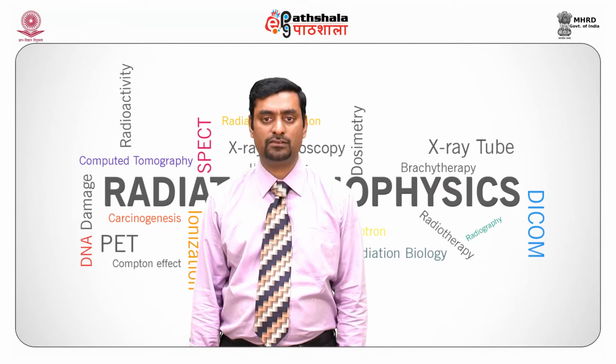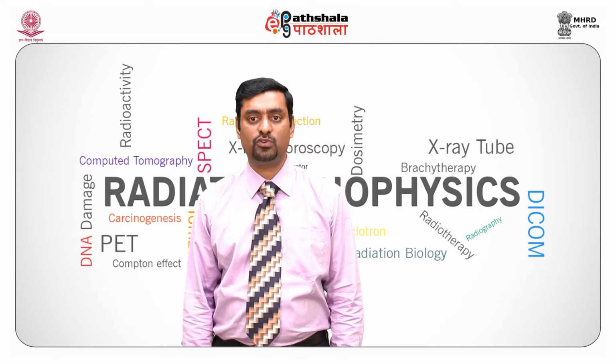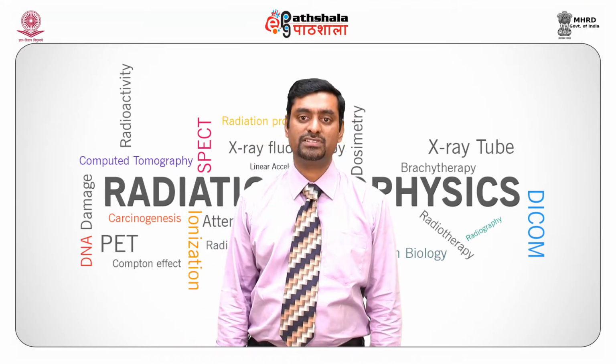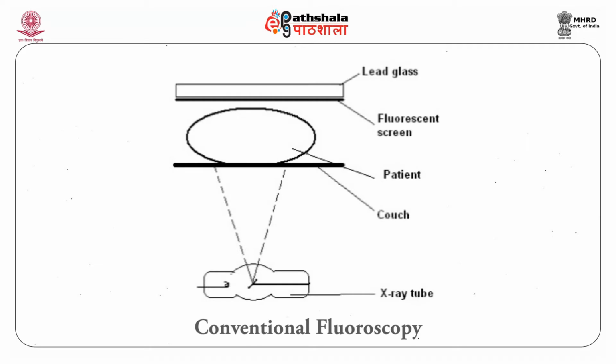Conventional fluoroscopy. This was used for more than 100 years. When X-rays pass through a patient, they are attenuated by different internal structures of the body and cast a shadow of the structures on the fluorescent screen. In this photograph, we can see a radiologist imaging a lady who is probably swallowing barium and is seeing the internal structures of the body with the help of an X-ray machine as well as a fluorescent screen. In this illustration you can also see the X-ray tube, a couch where a patient can be lying down, a fluorescent screen, and on top of it a lead glass.